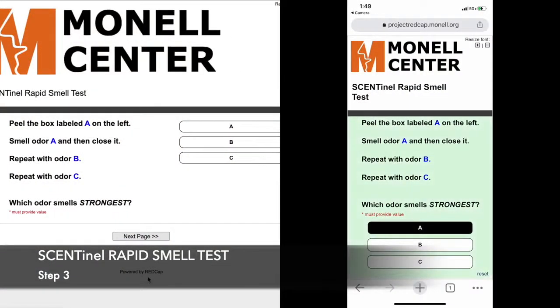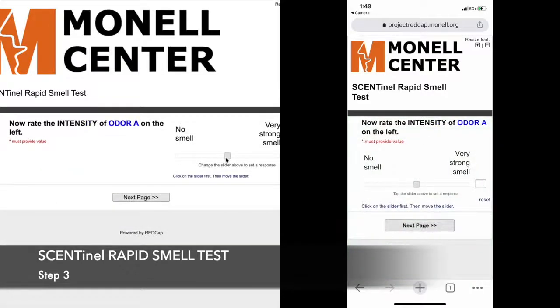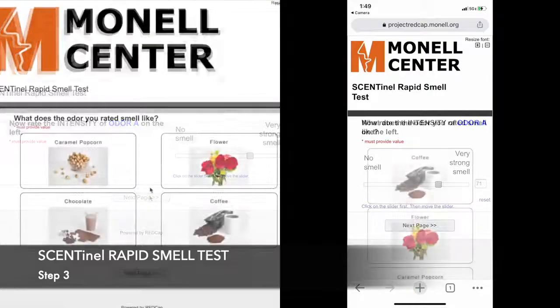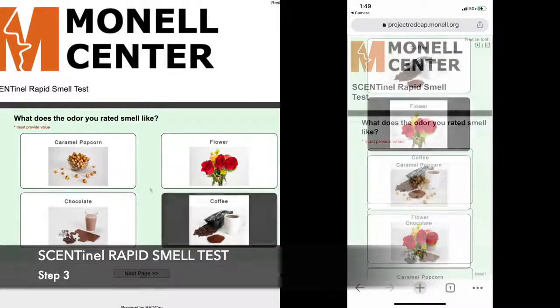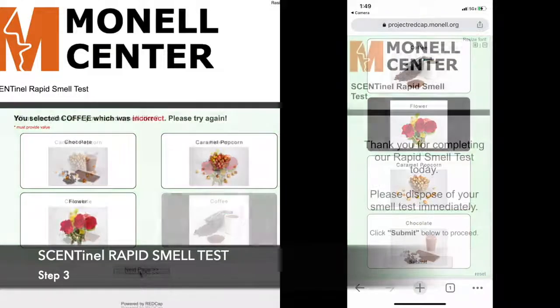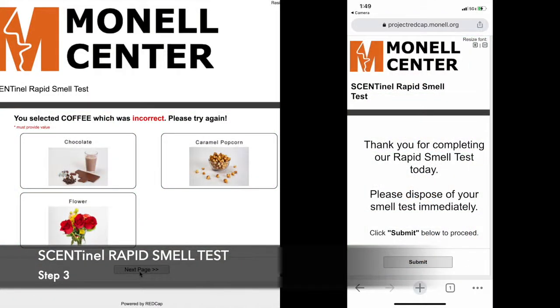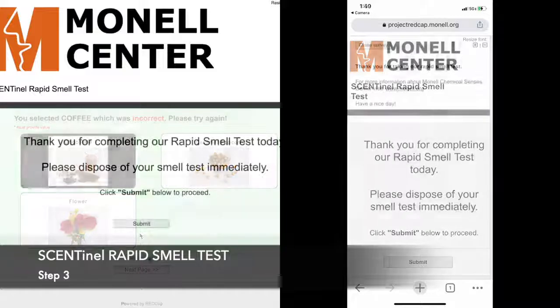Next, you'll rate the intensity of the odor you detected by using your cursor or finger, depending on the device, to move the slider to the left or right to correspond with your perception. Then, please choose the picture that best represents the odor you detected, and if you didn't detect an odor, we'd still like for you to guess. If the rating is correct, or you made a second guess, you'll be brought to the end of the test.